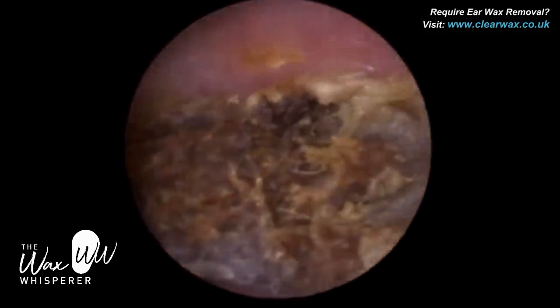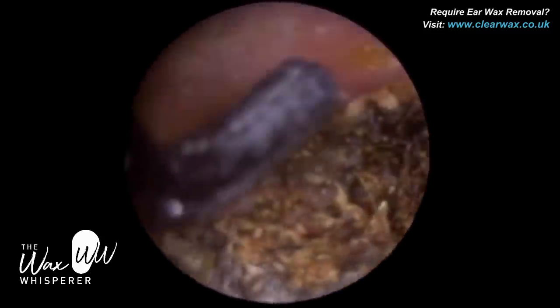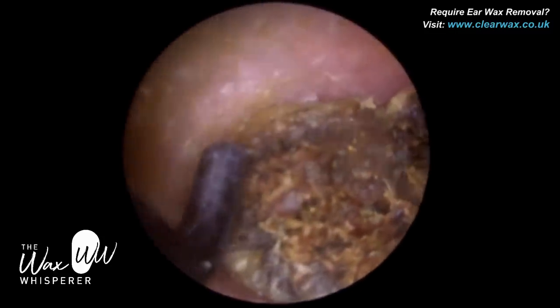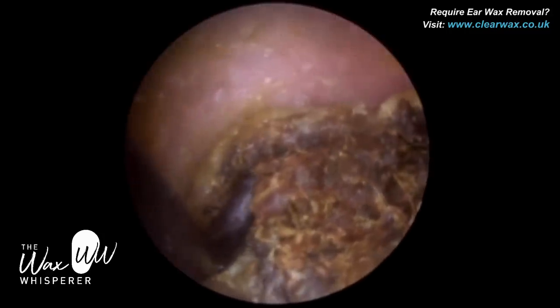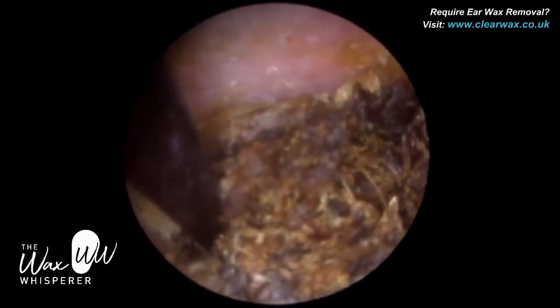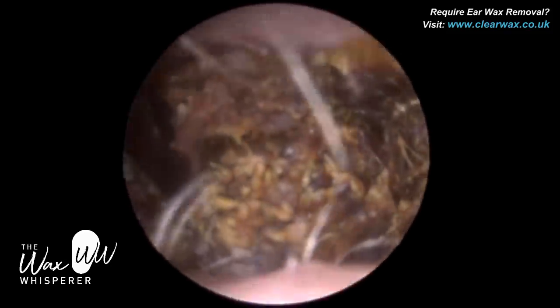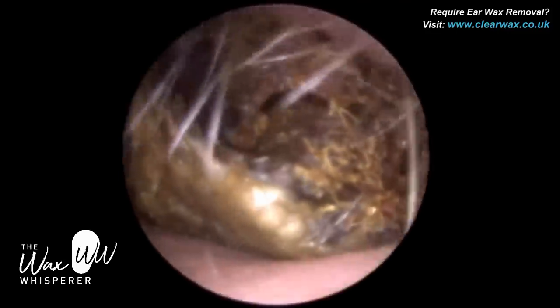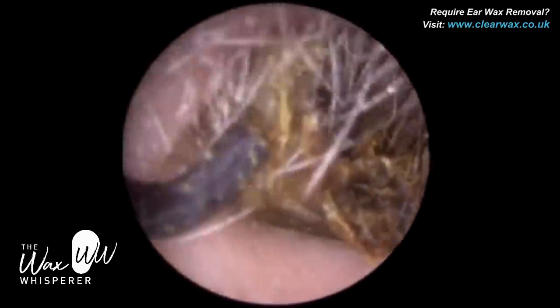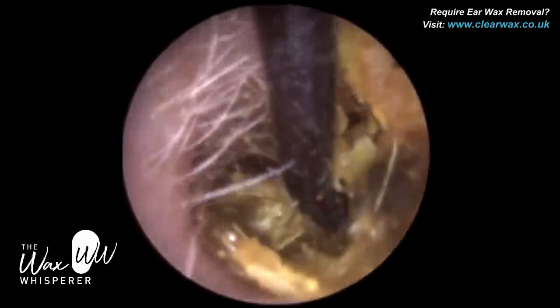Throughout the procedure the patient is completely comfortable — sometimes patients find procedures quite therapeutic. I've just gone to the roof of the canal and I'm just bringing this forward. As you can see, I've managed to literally drag this plug of wax and its coating laterally.